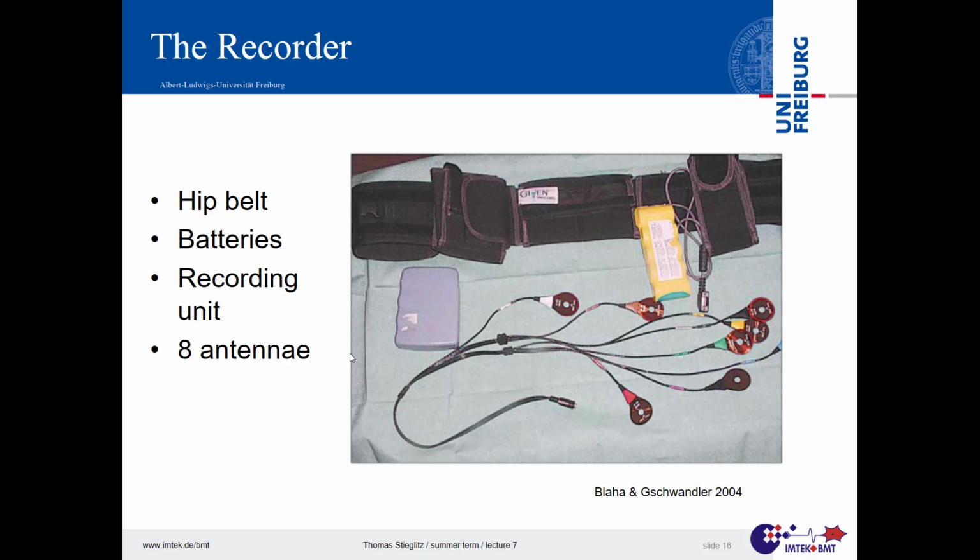And then, and this is another important thing, they were so successful because they did systems design, not only a single component or working principle, but a whole complete system here. A belt with cables, with battery packs for the receiver to receive all the data out of the capsule, and those coils had to be glued somewhere over the body so that you can triangulate from each and every position where the capsule is.